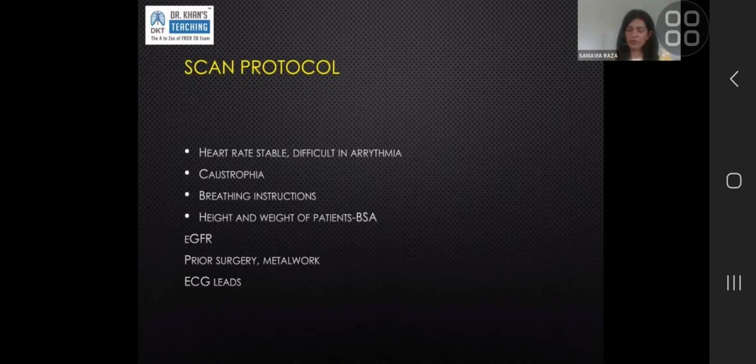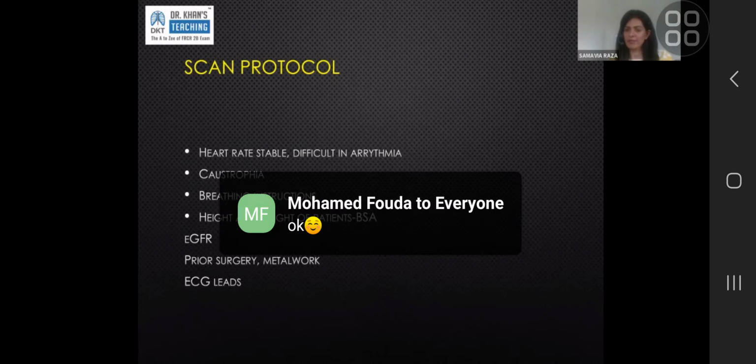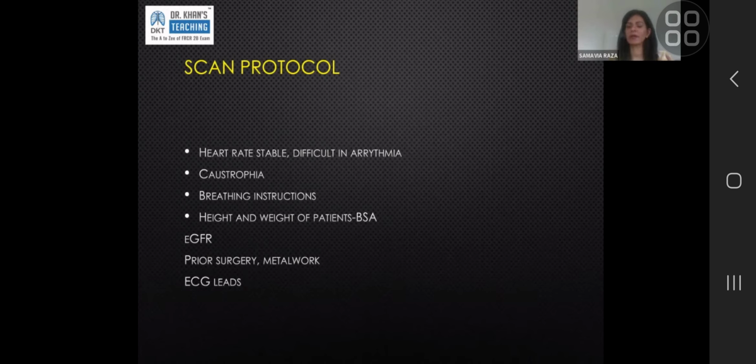Claustrophobia is a huge issue in cardiac MR. It's an issue for any MR, but cardiac MR is a long procedure. A minimum of 40 minutes the patient spends inside the scanner, no matter how quickly you go through all the images. It is a long time to be in a small space, especially if you suffer with claustrophobia, especially if you're big, because you can't make the bore any bigger. Because you have heart patients, they have trouble lying down flat anyway. They may get breathless lying down, they may have pleural effusions. And on top of that, a bit of claustrophobia, and you ask them to lie still supine for 45 minutes.